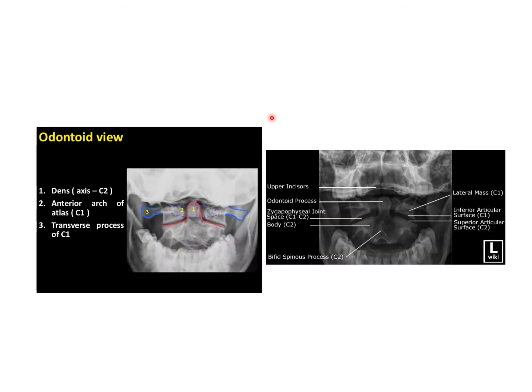Now this is another view, the odontoid view or open mouth view. This is mainly done to study the dens, the atlas, and the axis vertebra. Here you can see the dens, then the anterior arch of the atlas, and the transverse process of the atlas.